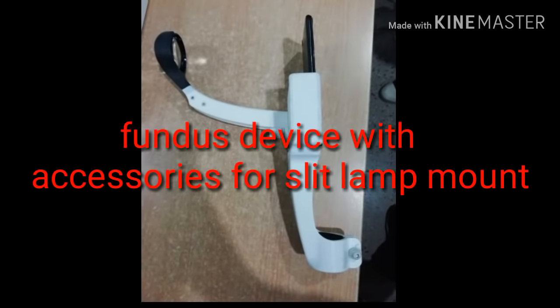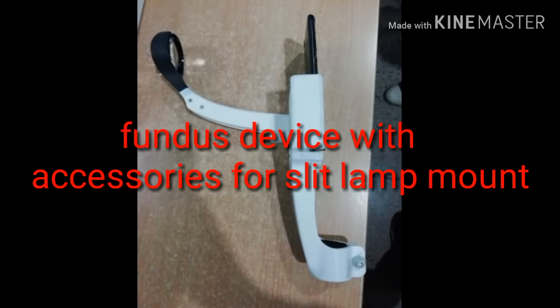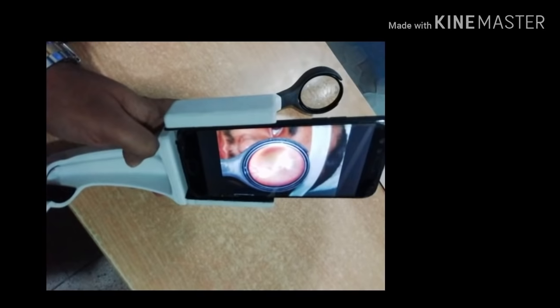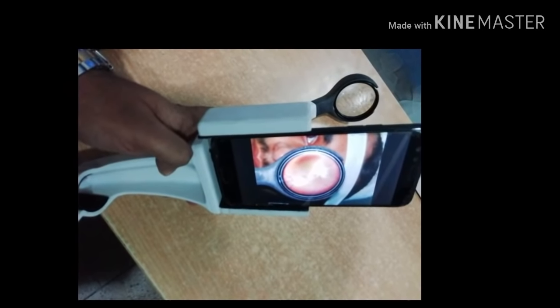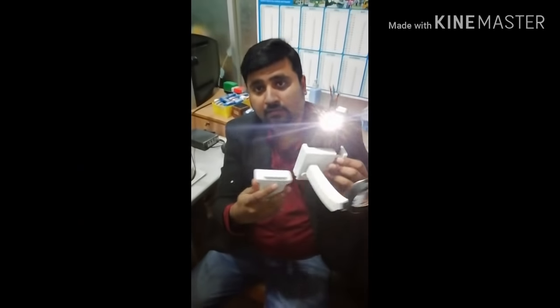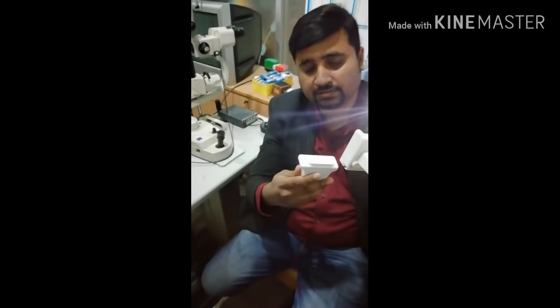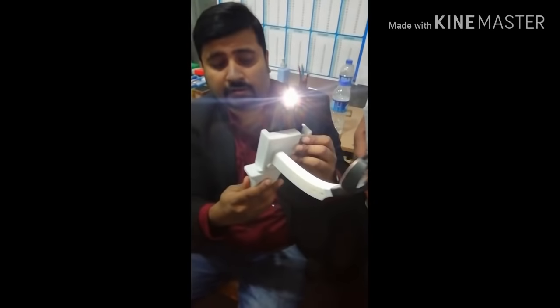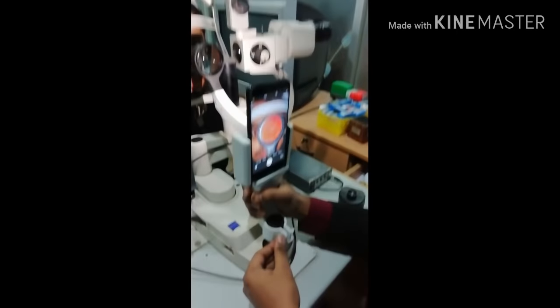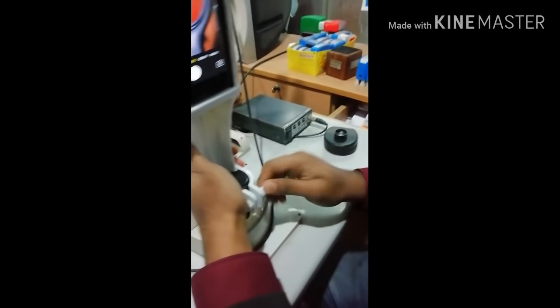We have to attach the accessories with this device. After that, we can mount it easily with the slit lamp. After mounting, we can make it adjustable by screw, and then further adjust it with the slit lamp joystick.